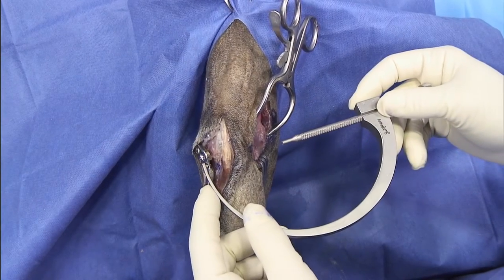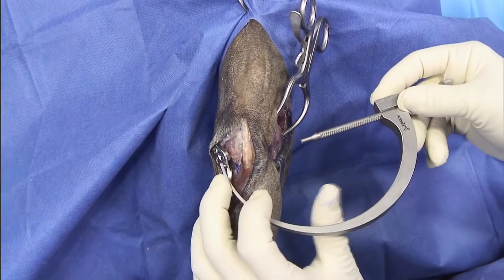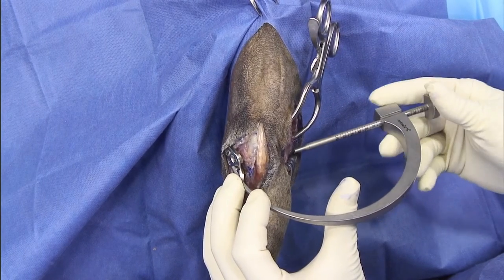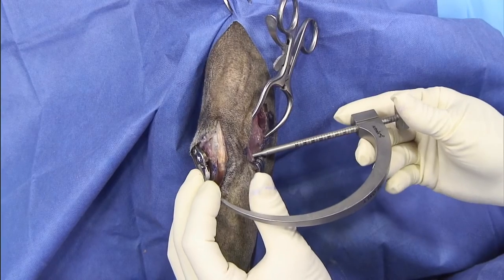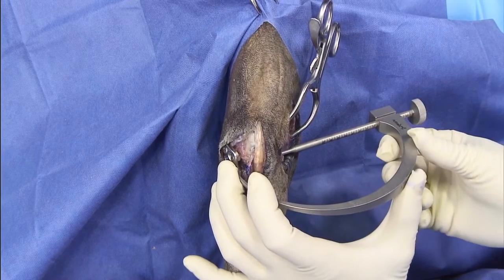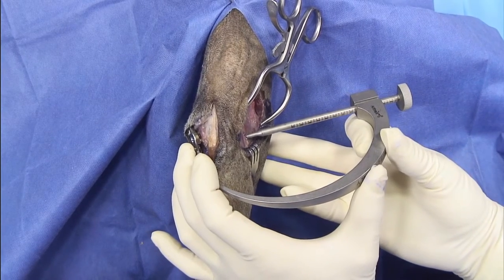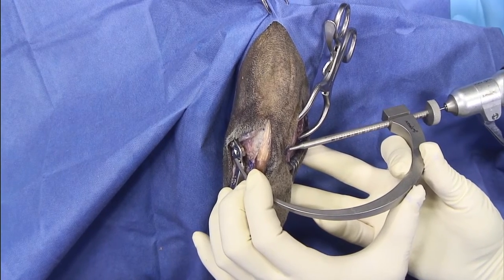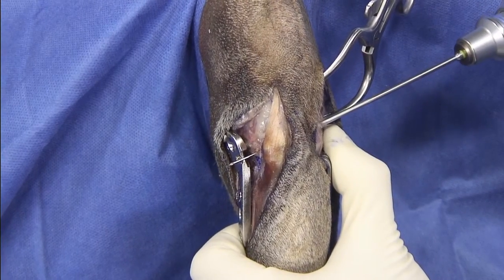Now we're ready for drilling the tibial tunnel. We're going to use a femoral aiming device and insert it into the suture hole of the plate, keeping some pressure against the plate. We're going to find the Gerdy's tubercle position right here. I generally like to have an assistant insert the K-wire because I want to be sure I'm holding the position well. I also suggest not tightening the guide too much so the aiming device doesn't bend. We're ready to drill with a cannulated drill bit.